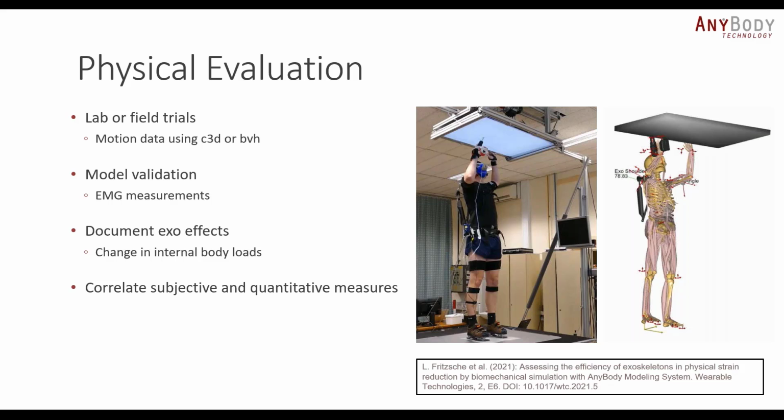And then along with the musculoskeletal model and the other measures that you may have, you can document the effects of the exoskeleton and how it's changing the internal body loads, make some detailed investigations, and maybe try to correlate some subjective and quantitative measures.